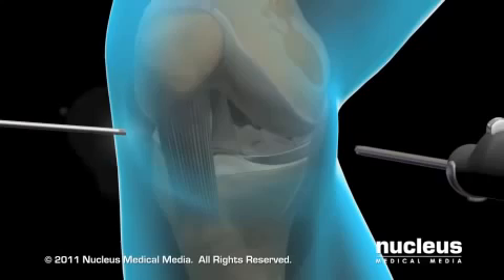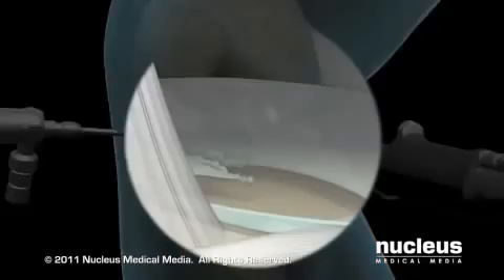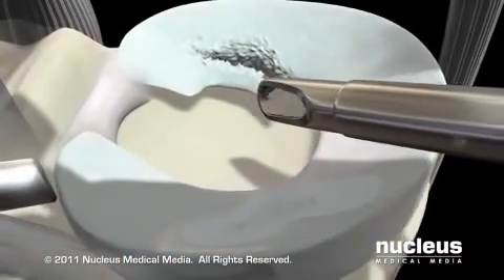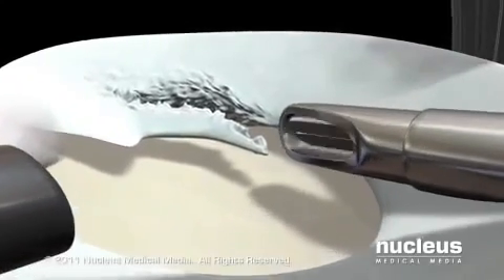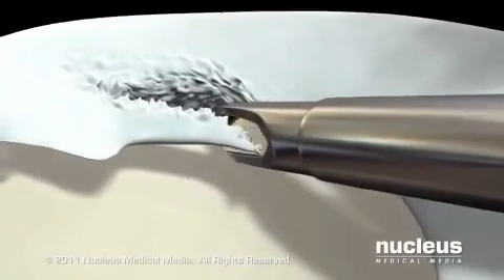Next, your surgeon will insert the arthroscope and other instruments through the various ports. Images from the arthroscope's camera are magnified and projected onto a video monitor. Your surgeon will carefully examine the inside of your knee joint, locate the damage, remove any loose or severely injured parts, and use a shaving instrument to smooth any jagged edges.